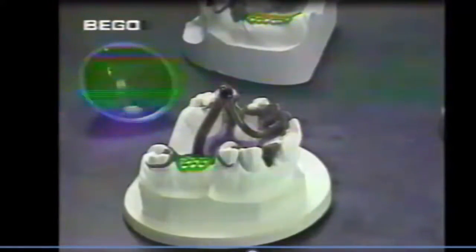And once again, to remind you, fix the casting funnel former in the middle of the model 10 millimeters above the wax-up. The mold ring must fit on the base without any gaps. Wax in place if necessary. Mix the investment material manually for 15 seconds and then for 60 seconds under vacuum with a power mixer. Allow the investment material to set for the specified time.